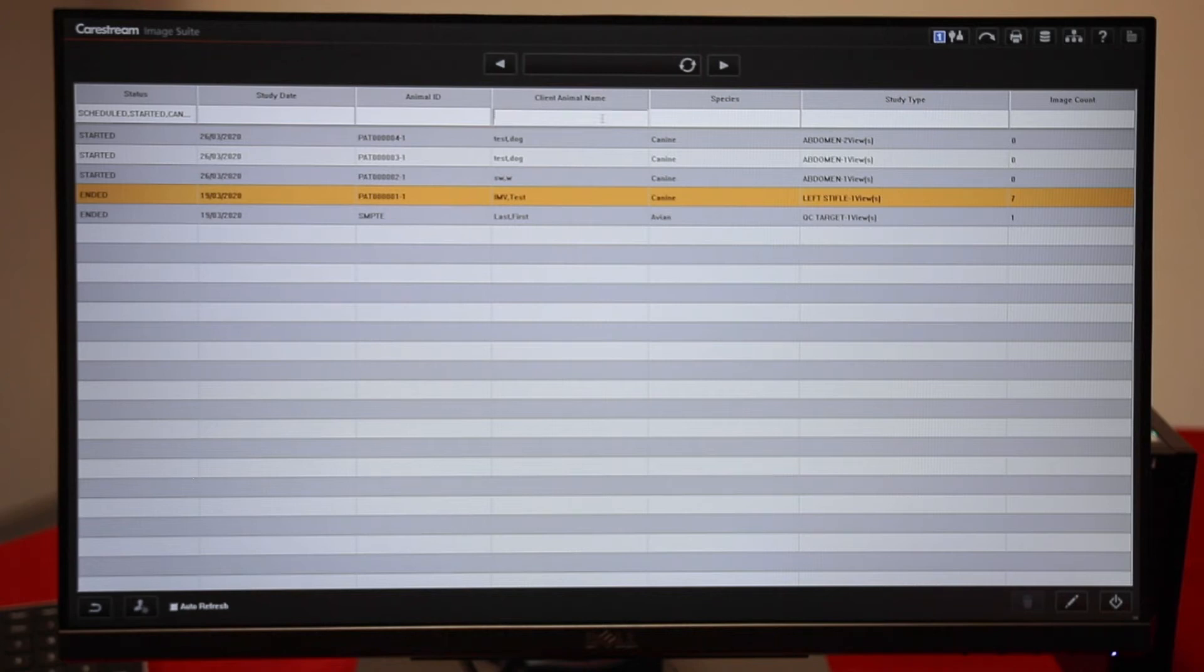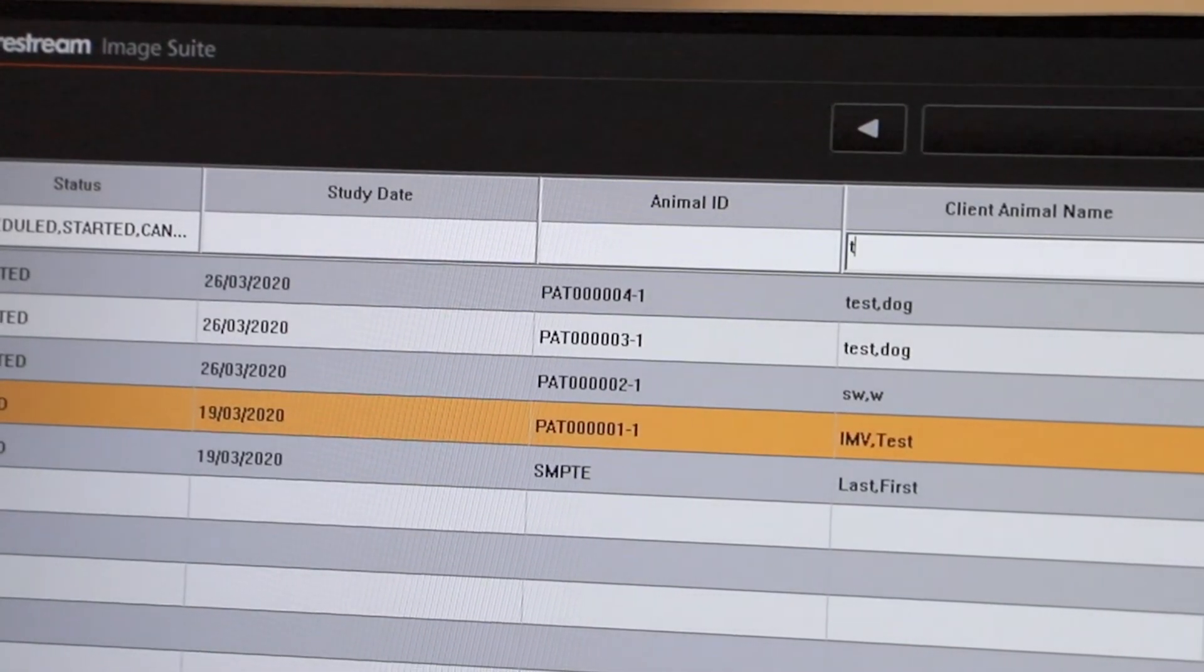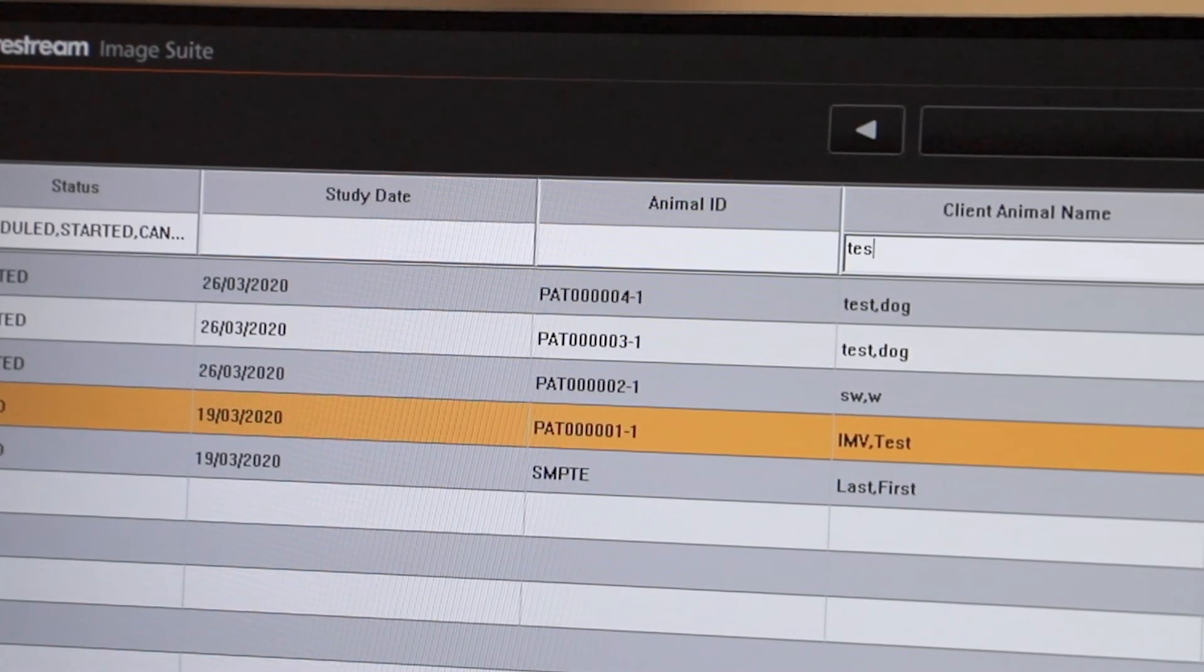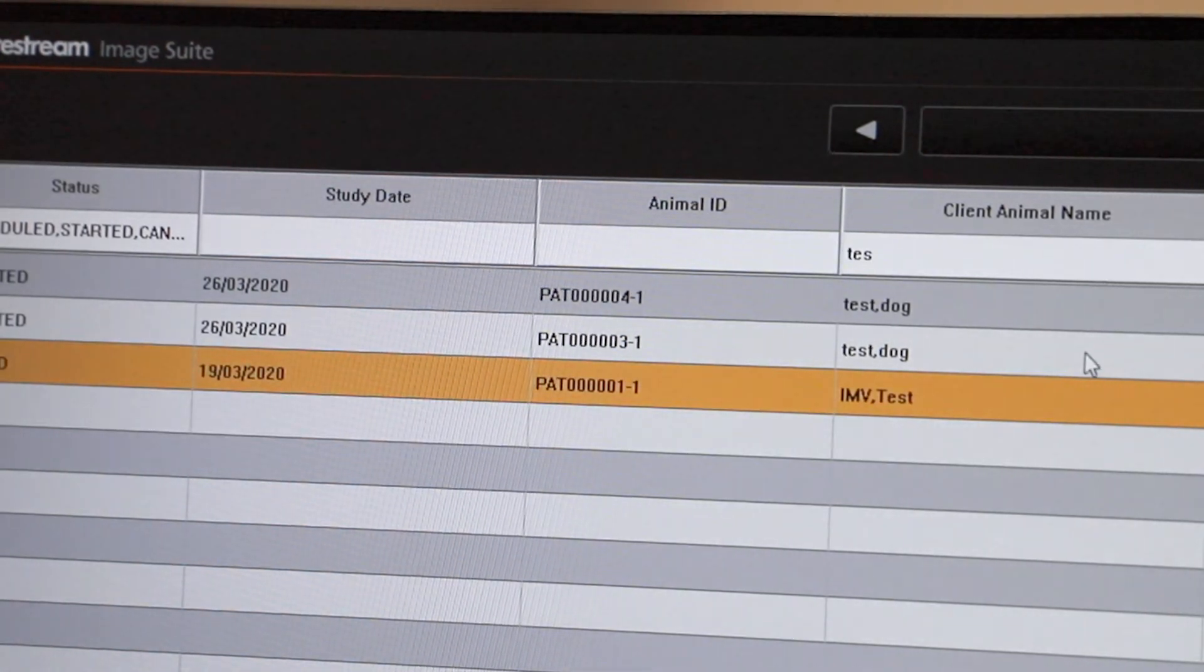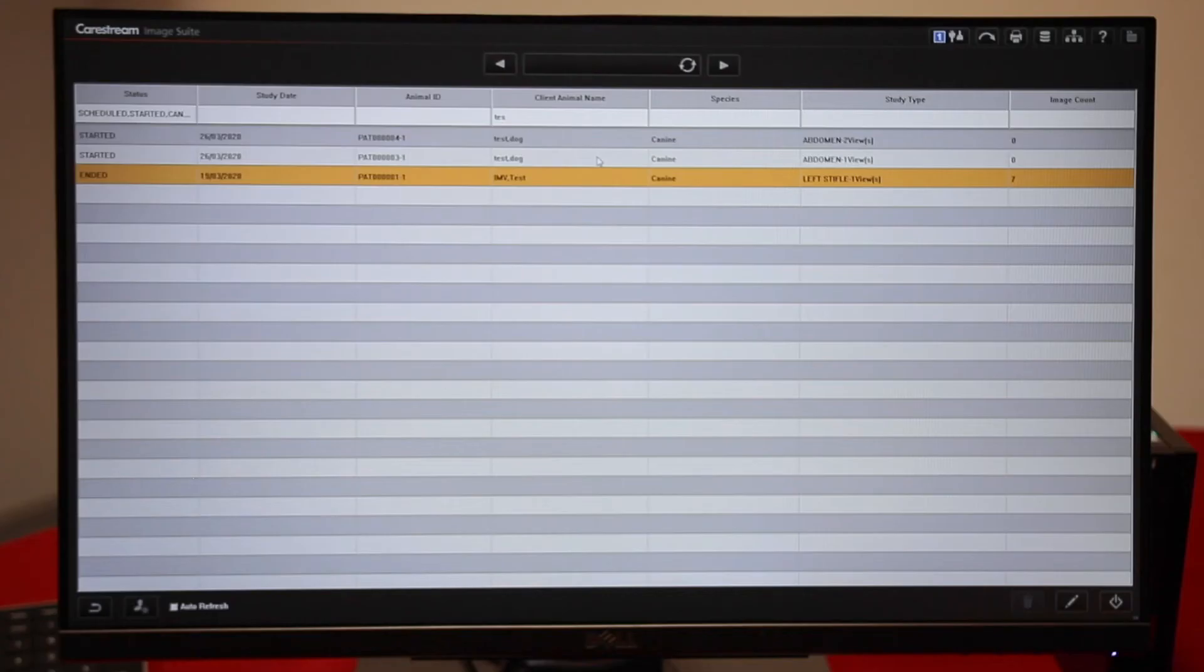Typing in any part of the animal or owner name will bring up all the listings.